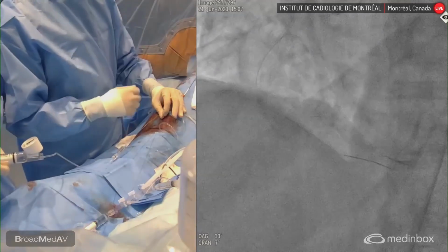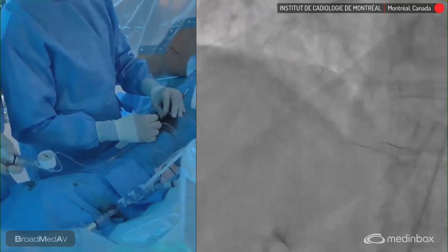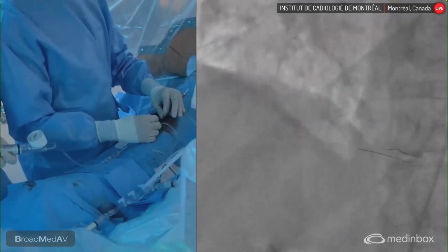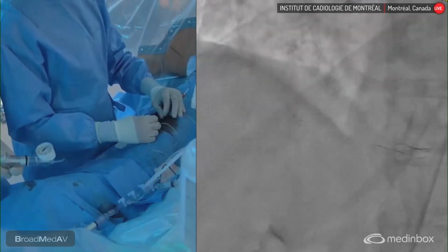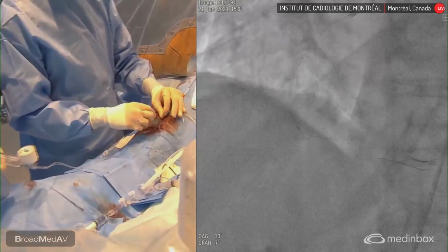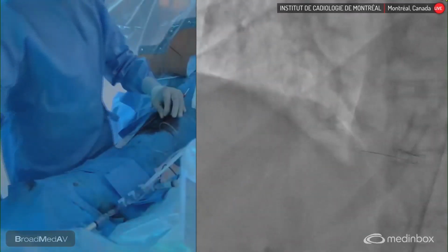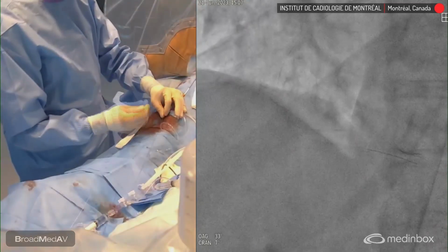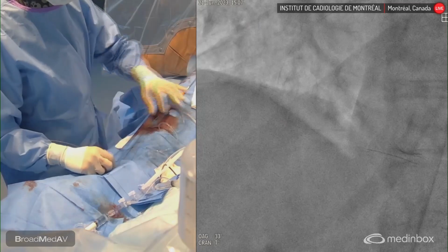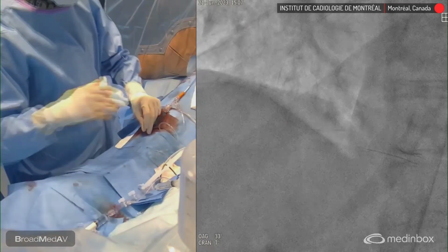That's very important. Second is that you need to assess the angiogram carefully from the beginning and plan ahead for plan A, plan B, plan C. Of course, this is absolutely key, and you have to be able to look at the angiogram. Dual injection is, of course, something that you cannot go around. You need to do this in order to fully understand the anatomy and the relationship between collaterals and the actual occlusion. And maybe if we can have the final slide, the conclusion slide on the screen would be helpful.